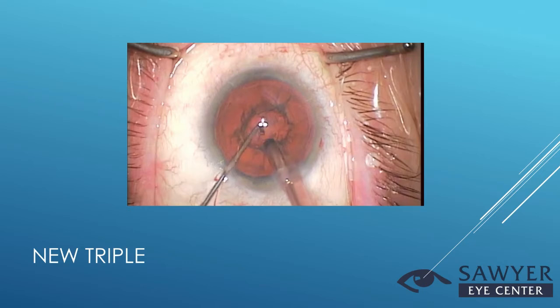These DMEKs now come stained and stamped so that you know when you've got the endothelium up or down. They come preloaded in the injection tubes. The eye banks are quite adept at these tissues nowadays, which makes cornea surgeons' lives much, much easier. Now, when you compare this to especially a PK triple procedure, you can see that it's just nowhere in the same ballpark as far as how safe it is and how atraumatic it is, comparatively speaking.